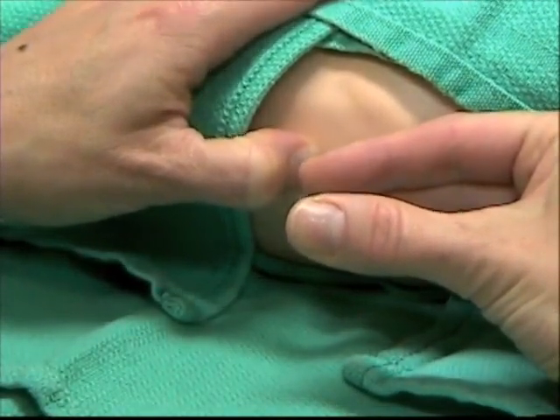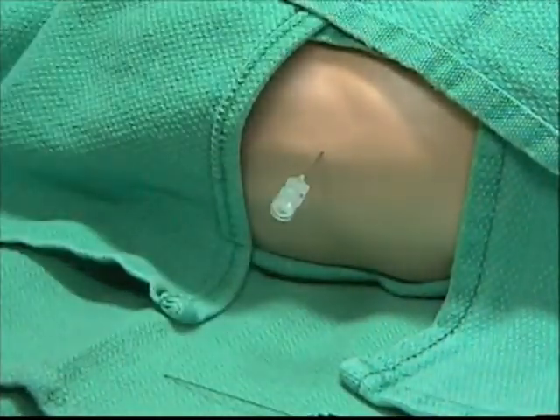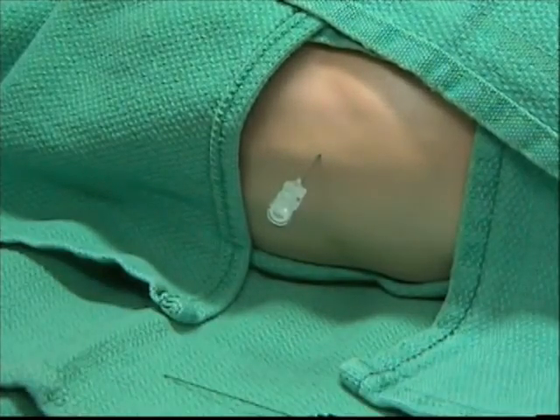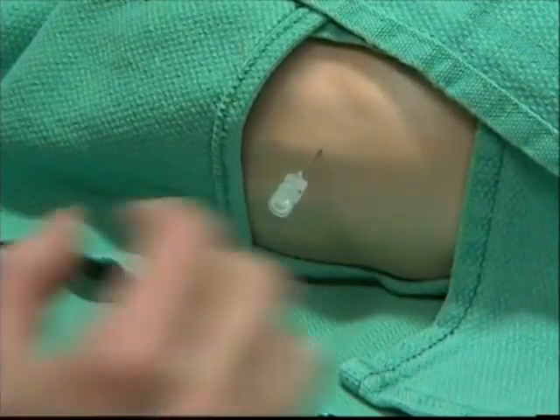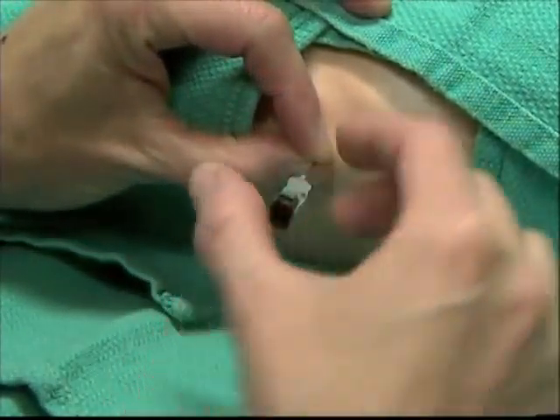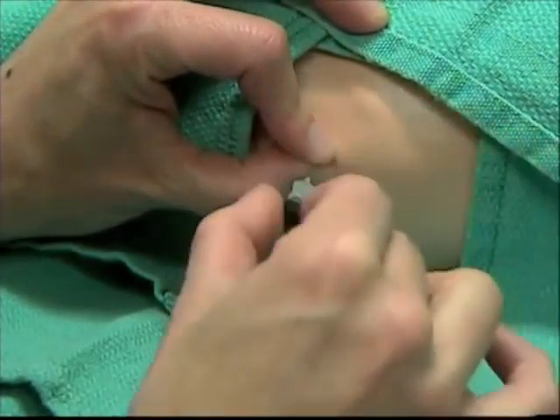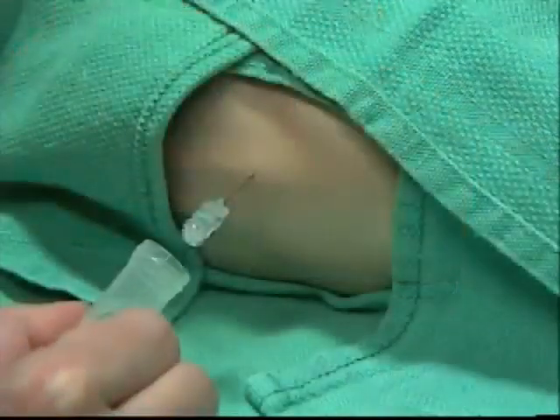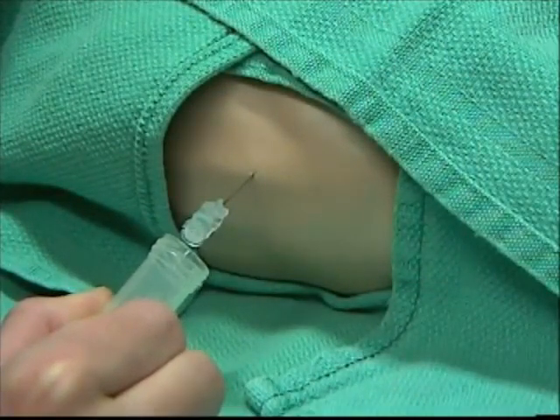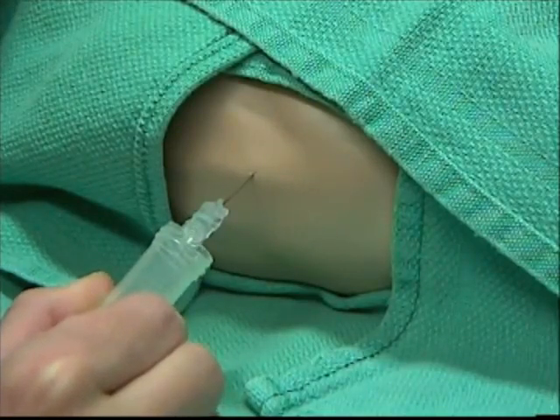As you move the needle in, you may or may not feel a change in resistance, often called a pop. If you're not sure if there has been a change in resistance, periodically take the stylet out and see if there is CSF flow. If you cannot get flow, put the stylet back in and go a bit further. Recheck periodically. Once you have flow, collect the fluid in 3 to 4 tubes. If you can, get about 1 centimeter in each tube.